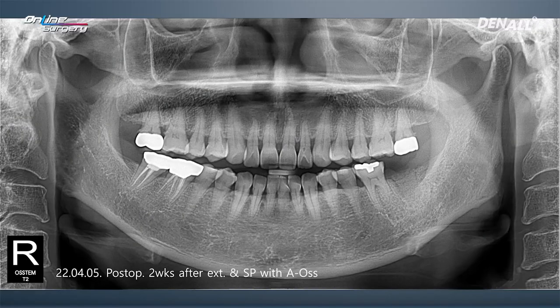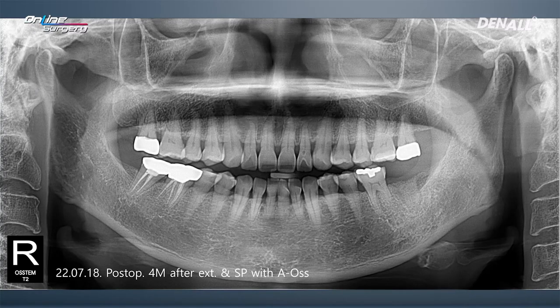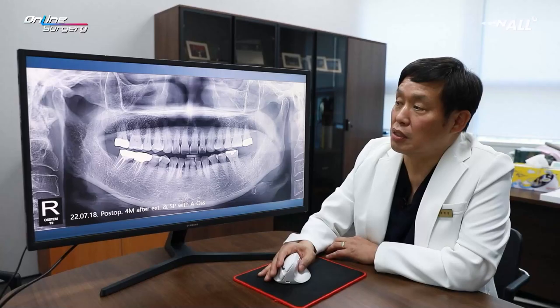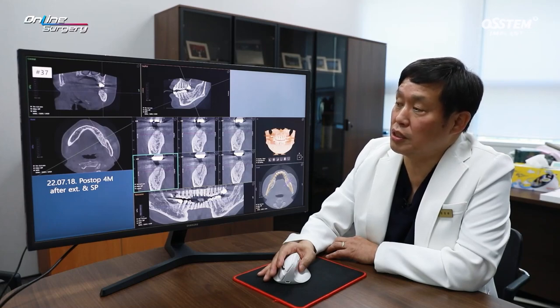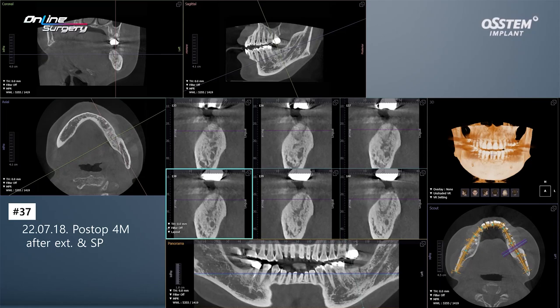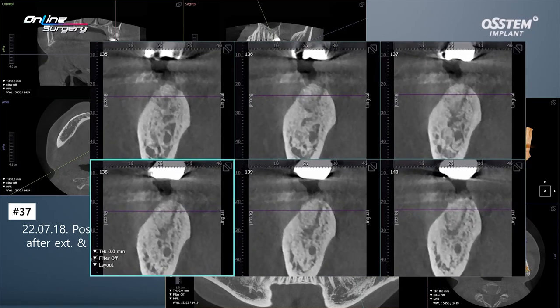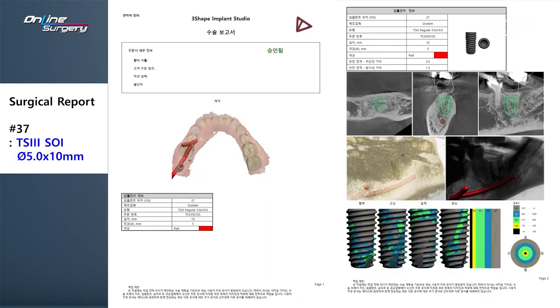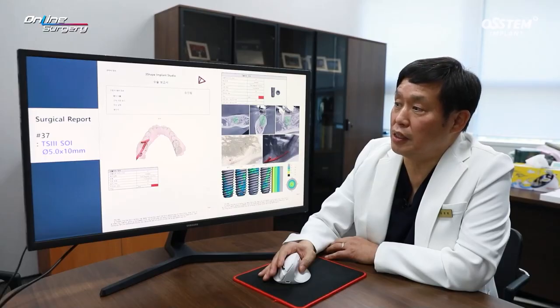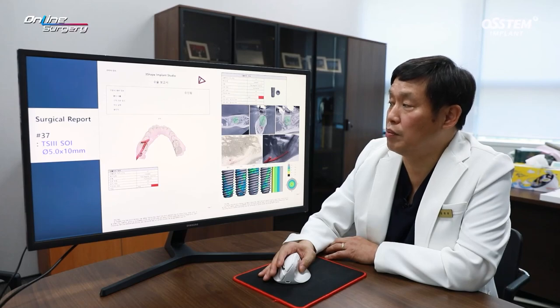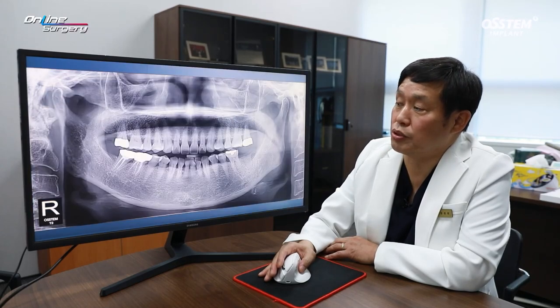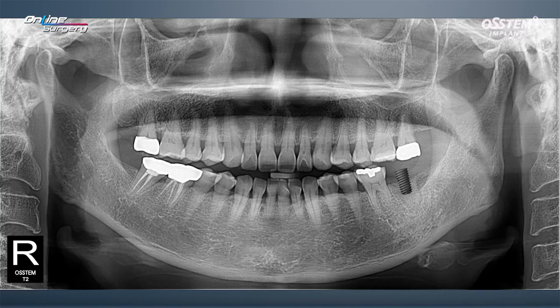This is the panoramic image after socket preservation — nothing special. About four months later, one guide was prepared. After taking CT, the A-Oss is being stabilized, so surgery was prepared. In order to use one guide, I made plans with the one guide team. A TSIII SOI surface 5.0x10mm implant was planned, and I decided to place the implant at this position.